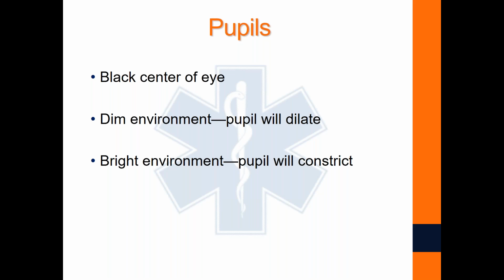It is entirely possible to check someone's pupillary reaction, say, out in the bright sunshine. But at that point, are we going to shine a pen light in their eye if it's noontime on an August day? Do you think that will elicit any change? Yeah. No. No, you just let the sun do it for you. Yeah. And my pen light's not brighter than the sun, so I'll cover both eyes and move one hand.